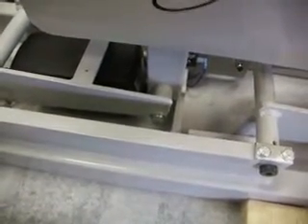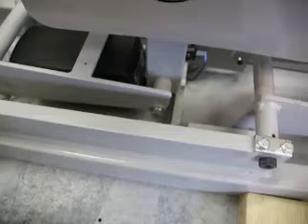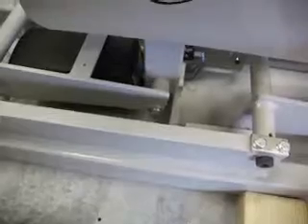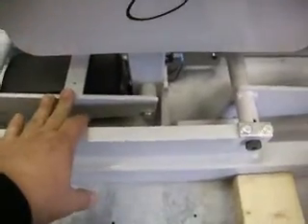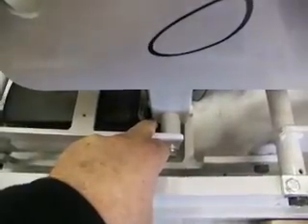Location process in this case is placing the table in its intended location in the clinic. While that table is in a blocked condition, if someone should apply power to the table and press the down button, this linear actuator, which is capable of lifting over 1,500 pounds, will find itself in a position where the table is mechanically blocked, and electrically, the linear actuator is being commanded to lift the table. The consequence of that will be that the linear actuator mount point here can be broken or damaged.